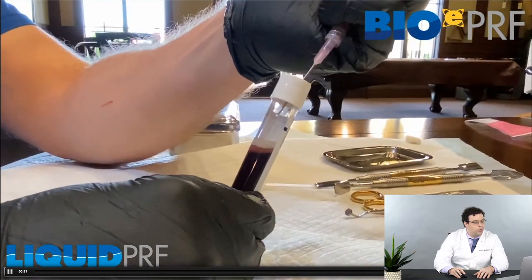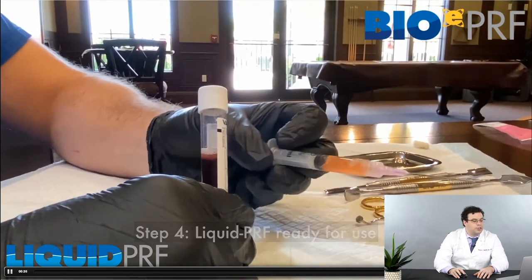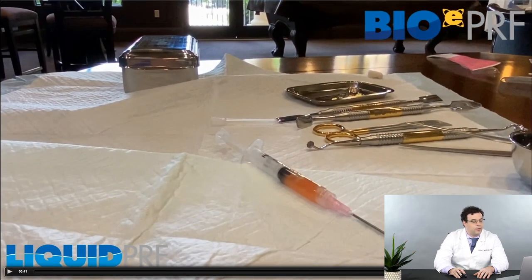Very important to go right to the buffy coat zone. One thing I see more commonly is people will just take out the upper half of the liquid platelet-rich fibrin. Always remember it's the lower half that's a lot more concentrated. If you have a few red blood cells, as you see here, no big deal.